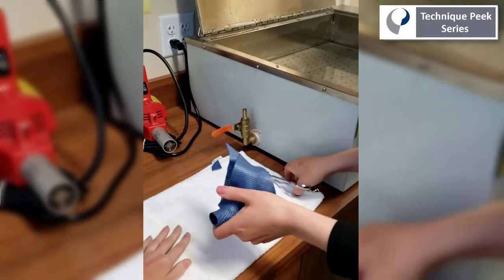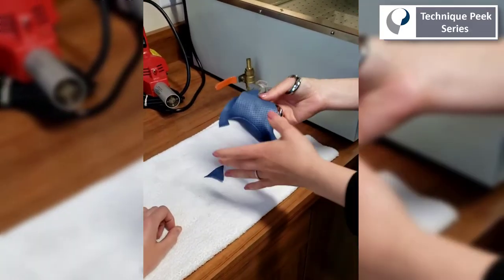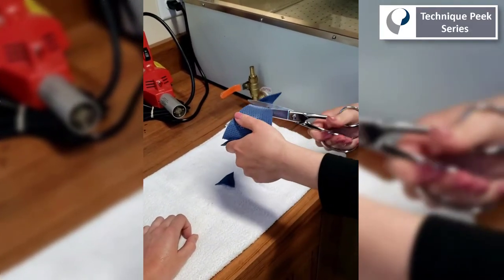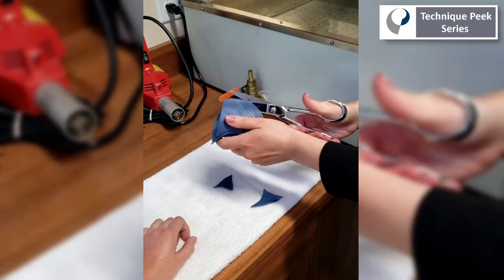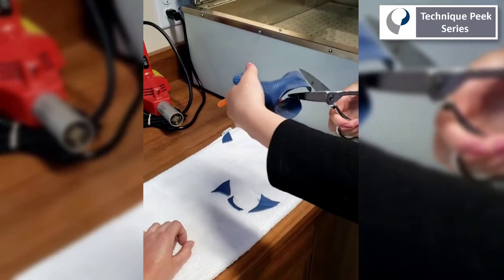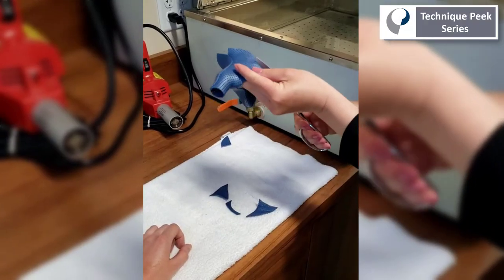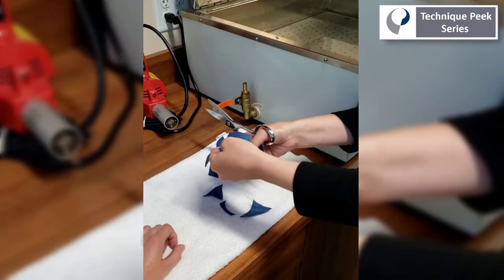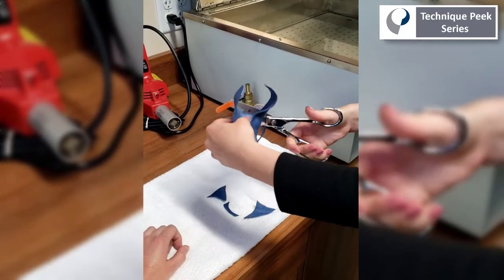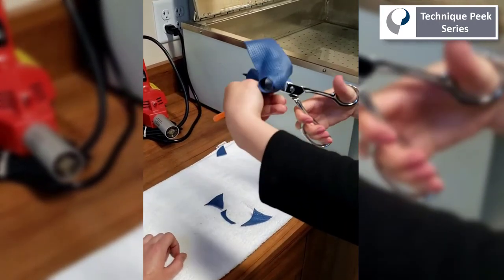The material in this video is an Orphe Light, which is good for cutting when cold. It's lightweight and not very rigid, so I tend not to use it for postoperative or fracture immobilization, but rather for pain conditions like CMC joint arthritis or something like a trigger thumb. The patients like the lightweight nature of it, and I like the versatility of it when fabricating a splint.